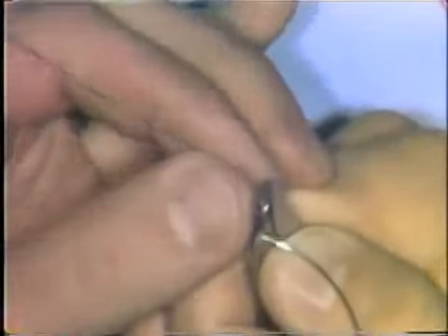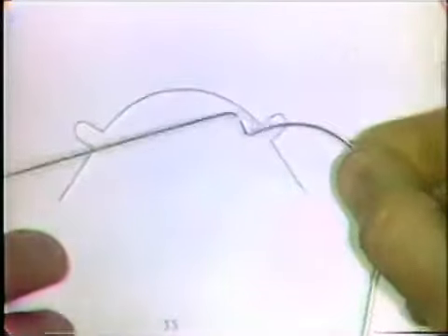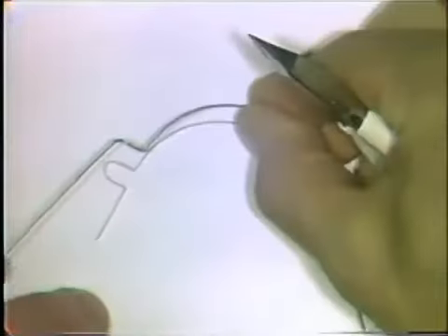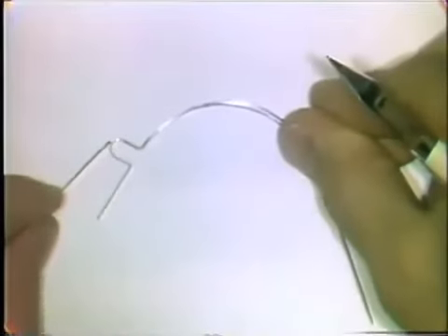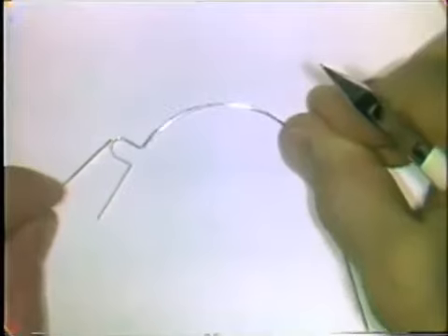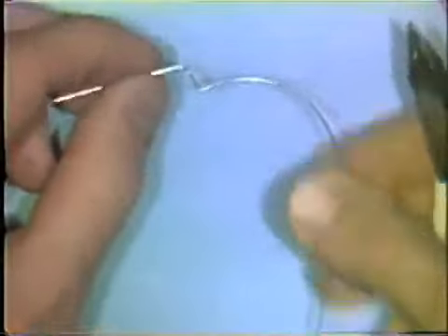Try to keep the wire in the same plane of space as the curve. After forming a little bit of the loop, try the wire back on the pattern to see if you're headed in the right direction. This will orient you, let you know what you have to do.